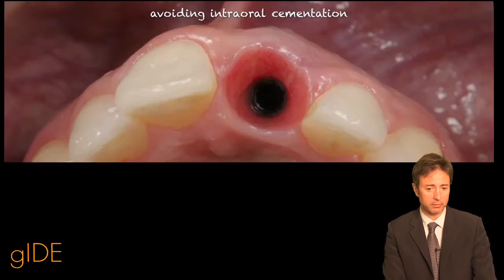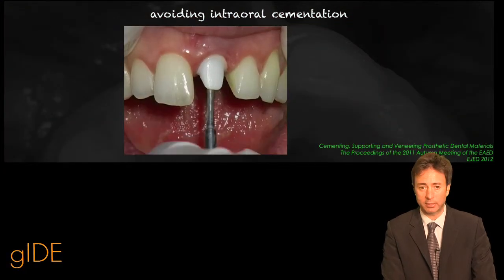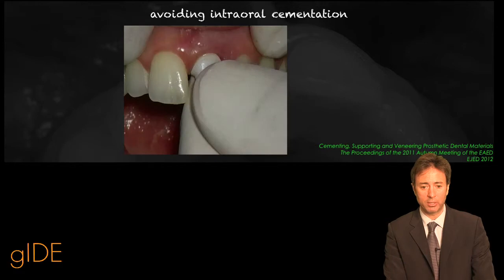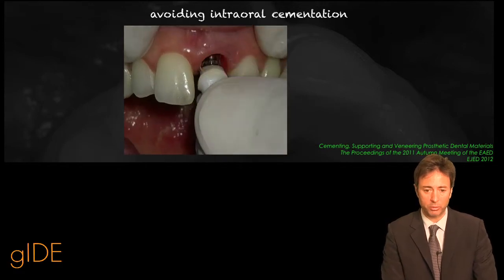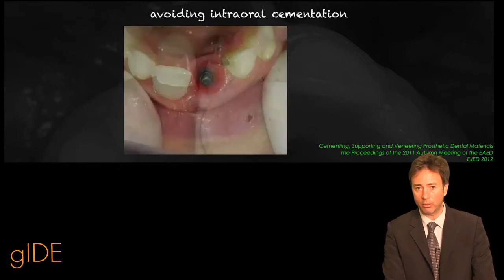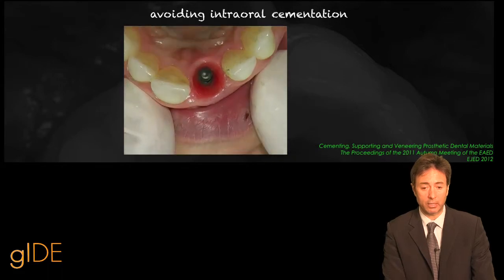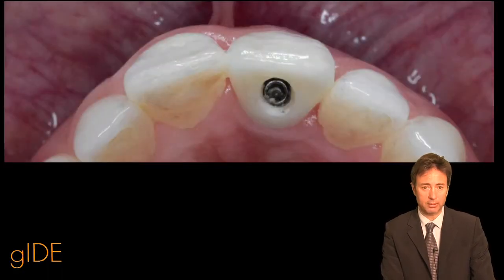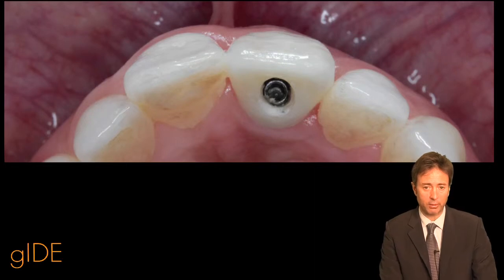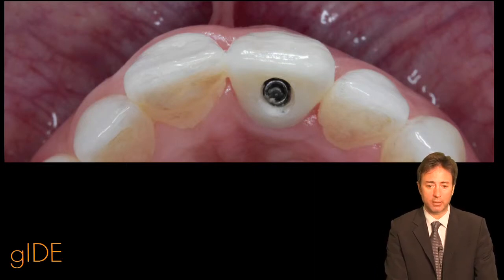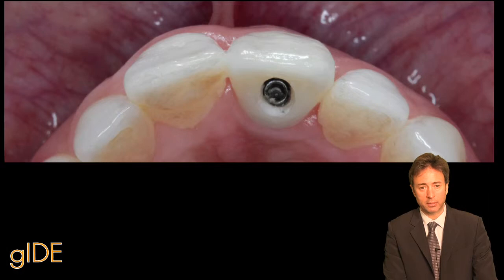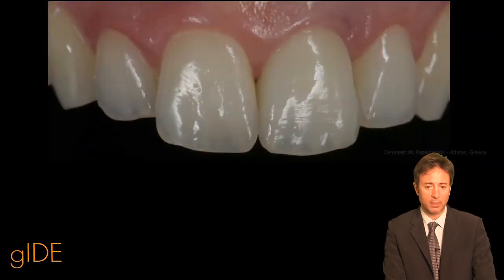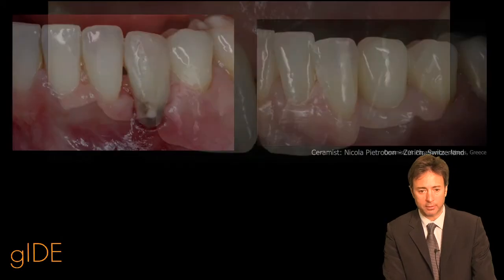When we place the implant, it is very important that we disconnect just one time. We will show you the whole procedure — how we do it and how we cement the crown extra-orally. It is very important that the implant is in the right position and that the access hole comes to the palatal surface, as you can see here.